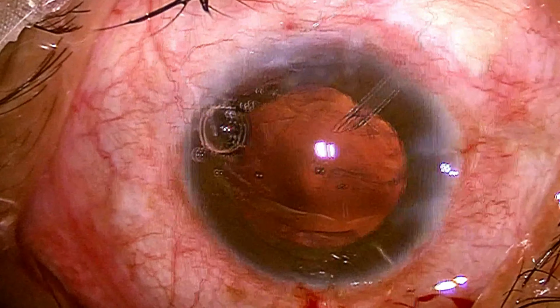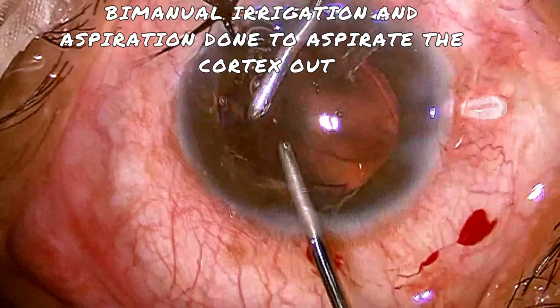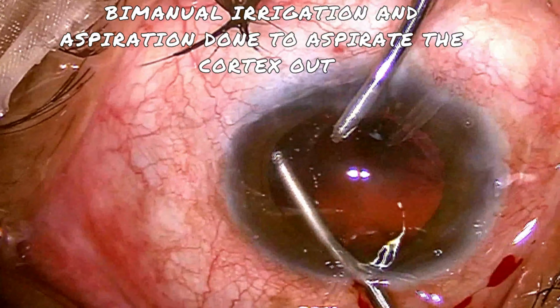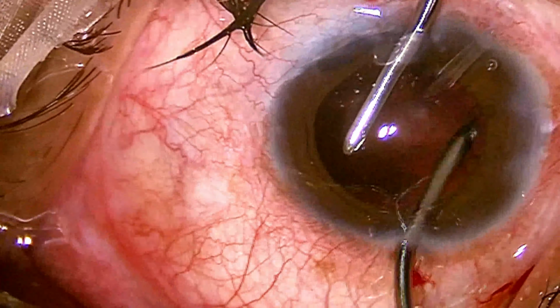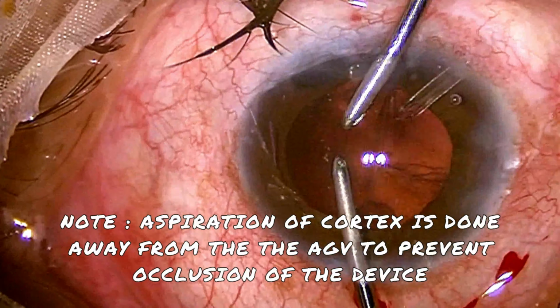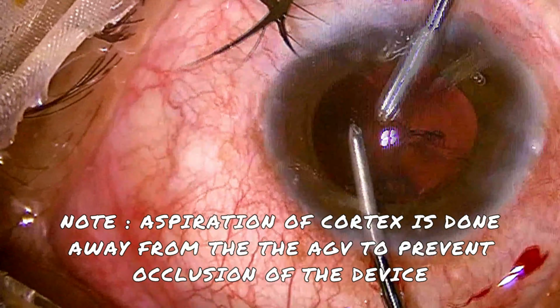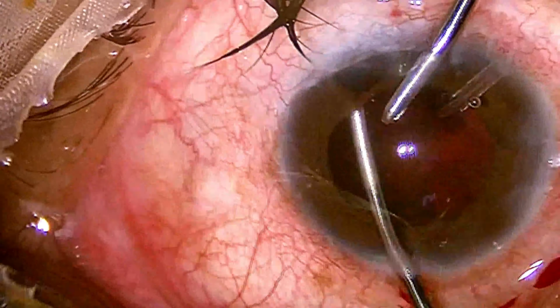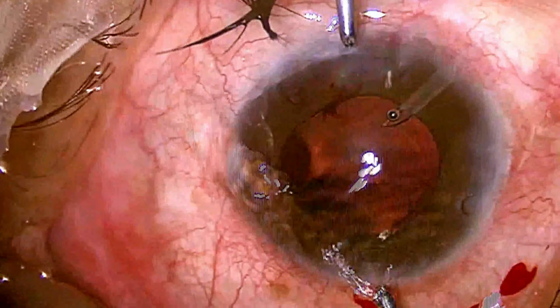Now, bimanual irrigation and aspiration is done to remove the cortex. Make sure no cortex or nucleus part remains or floats, as it may block the Ahmed glaucoma valve tube later on. Also, utmost care should be taken while doing the irrigation and aspiration that the probe should be away from the Ahmed glaucoma valve.